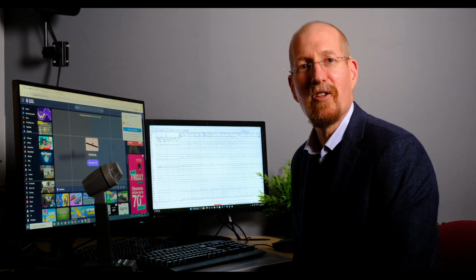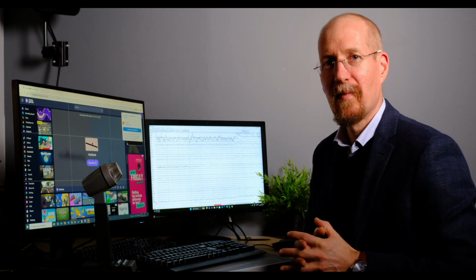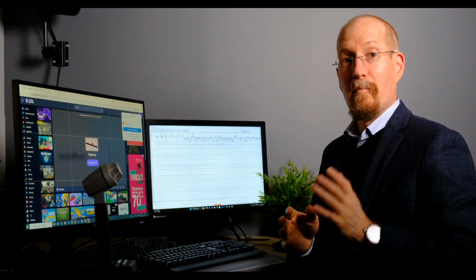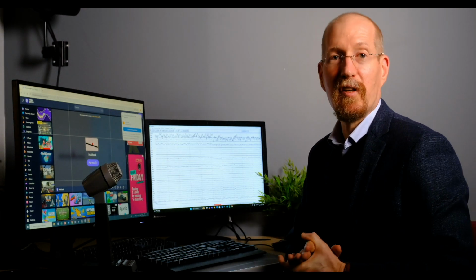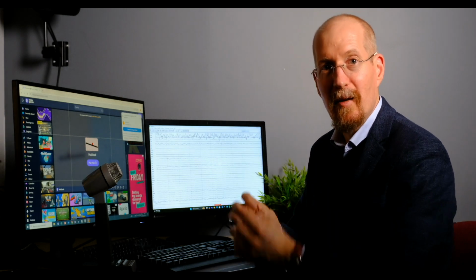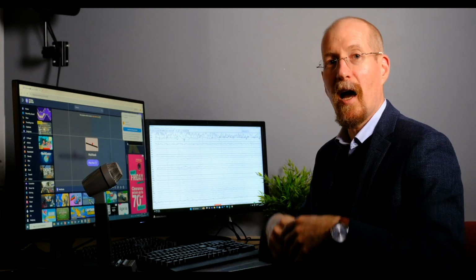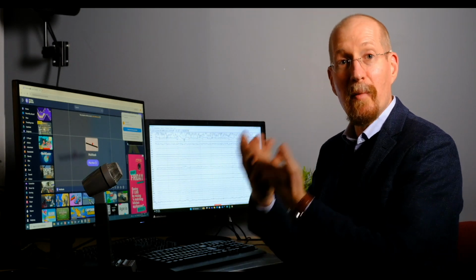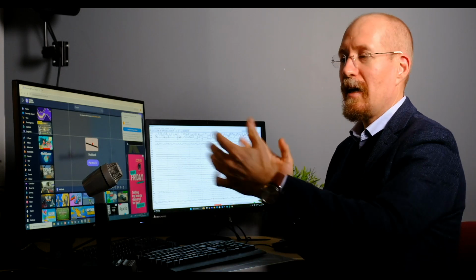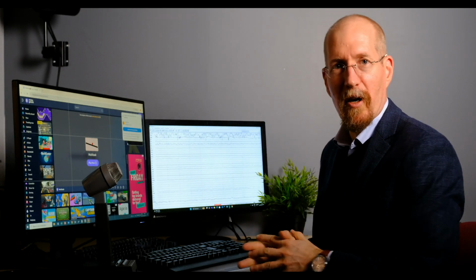Our next task, as I mentioned, is a multitasking task. It's going to start out easy, but it will gradually increase in complexity. Because I know ahead of time that it will increase in complexity, I'm going to wait until we move into a multitasking state before I enter in my marker for the start of the task. In that way, I'm going to allow the participant to acclimatize to the task, but at the same time, I'm going to minimize the extra unneeded amount of EEG recording that I should be targeting in my analysis.